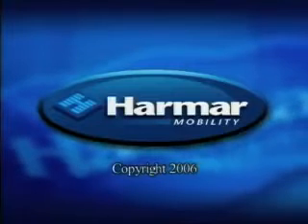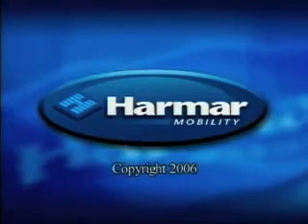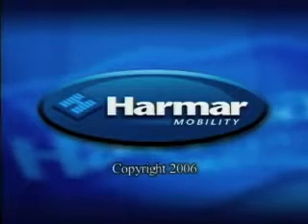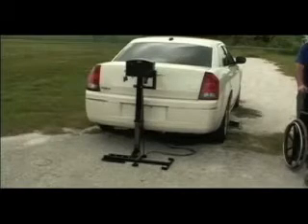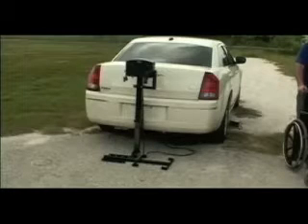This installation guide has been created to assist you in installing a Harmar lift. If you have any questions after viewing this video, please contact Harmar's Technical Services Department. The AL-030 power tow is designed to transport manual folding wheelchairs. Estimated installation time is 45 minutes, but a first-time installation can take significantly longer.